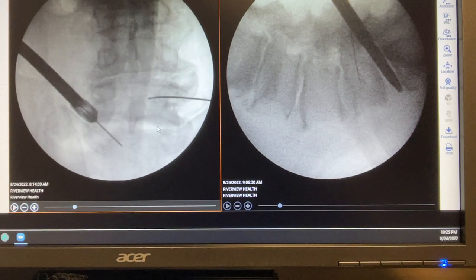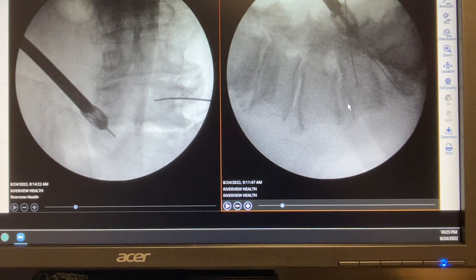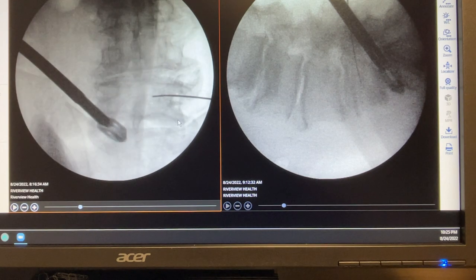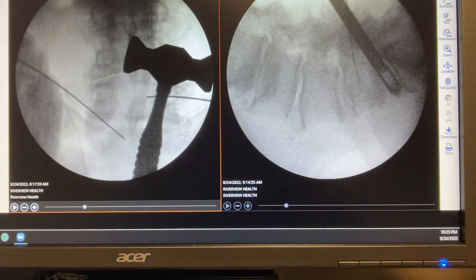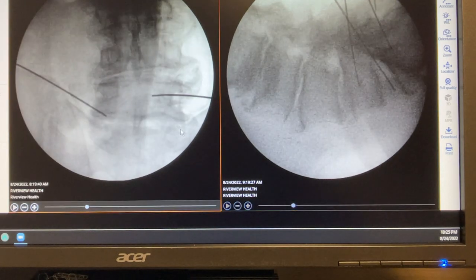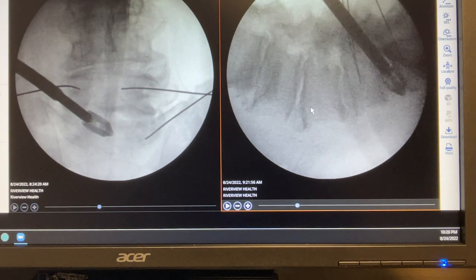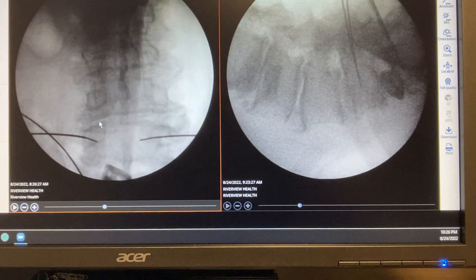Because the space is large, I want to put a big cage in — a 14-millimeter cage that goes in at low profile and then turns to expand to the shape of the disc. However, it was so sclerotic that I had difficulty turning the cage, so I removed it and put a smaller cage in. This process takes longer than usual, but I'm able to place the cage. At this point the K-wires at L4-5 are already in place.